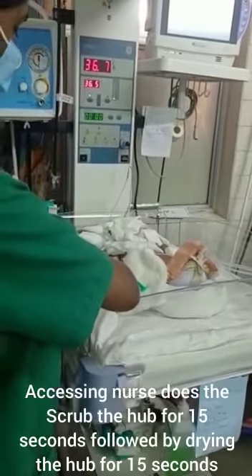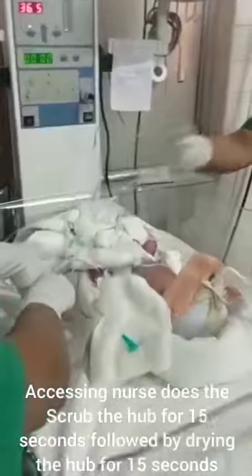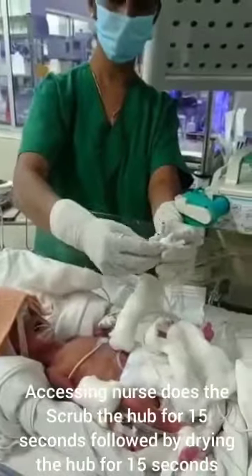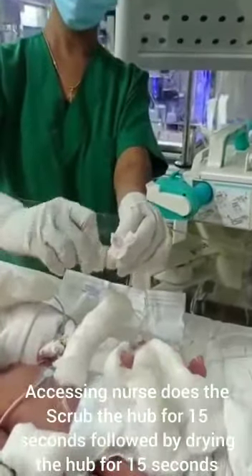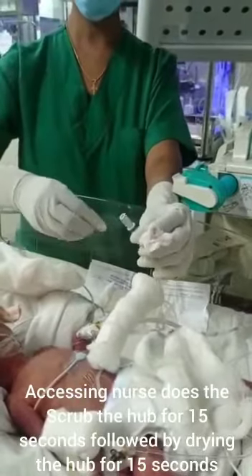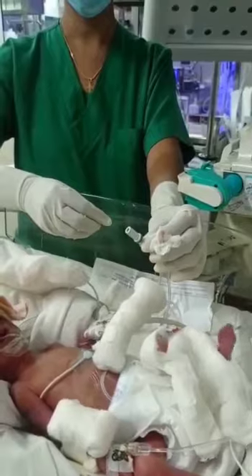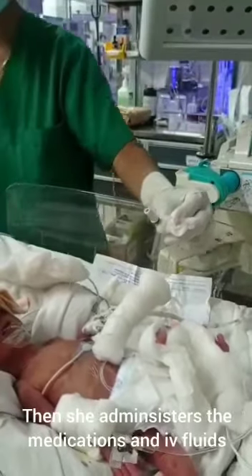The accessing nurse performs the scrub the hub for 15 seconds, followed by drying the hub for 15 seconds. She then administers the medications and IV fluids.